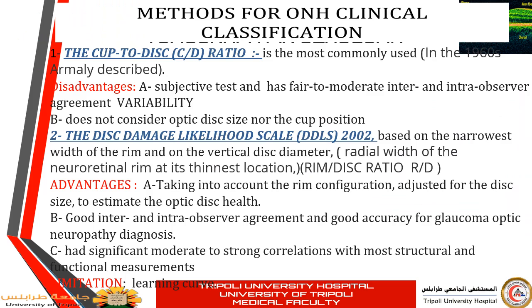In this slide, I will say a few words about the methods of clinical examination of the optic nerve.